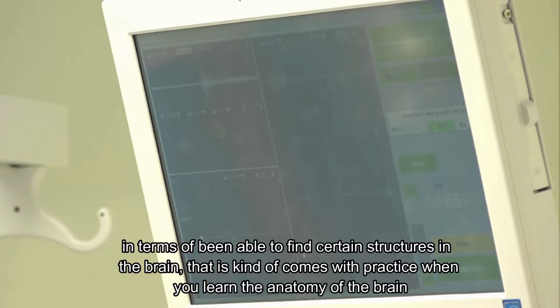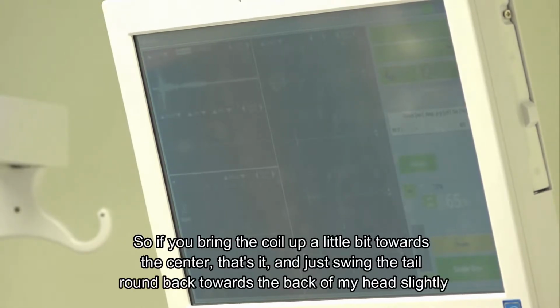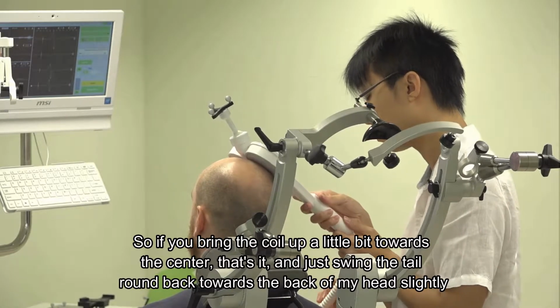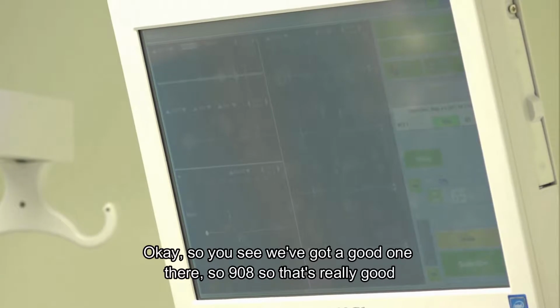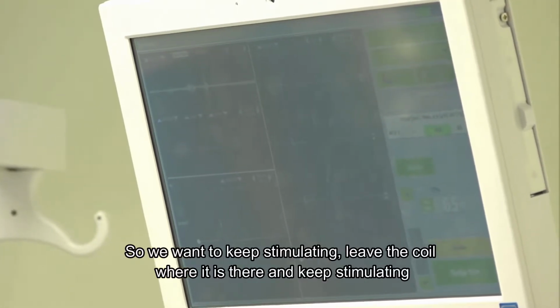So yeah, move. Okay. Shall I try again? Yeah. Okay. So that was down the side of my head there, so my jaw twitched slightly. So if you bring the coil up a little bit towards the center, that's it, and just swing the tail round back towards the back of my head slightly. Okay, that's good. Give that a go. Okay. So you see we've got a good one there. So 908. So that's really good. So we want to keep stimulating. Leave the coil where it is there, and keep stimulating.